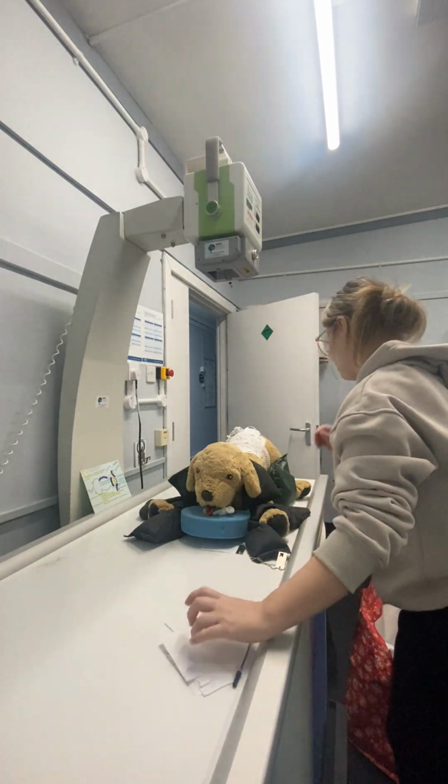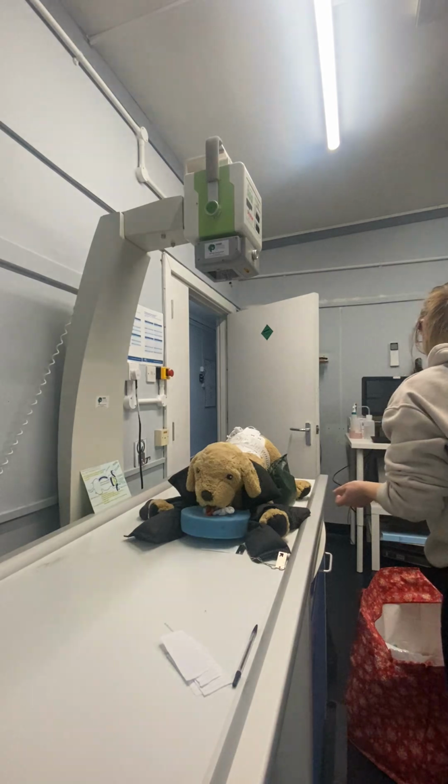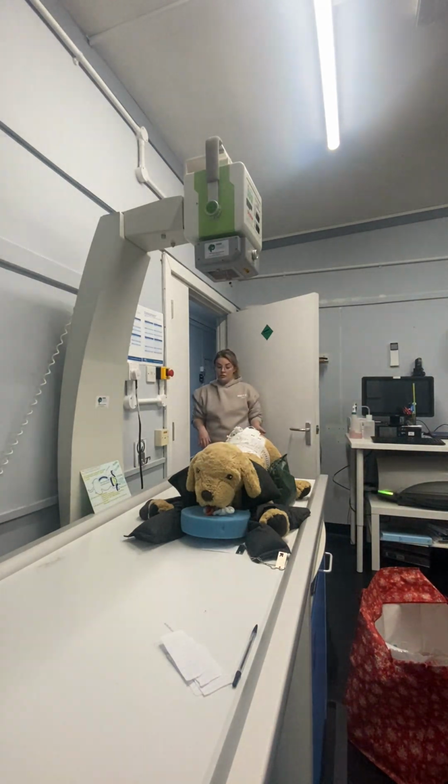Okay, so I'm happy to take the x-ray, so if you're happy to exit the controlled area with me. And then once we're in the safe space, we can take the x-ray. X-rays!